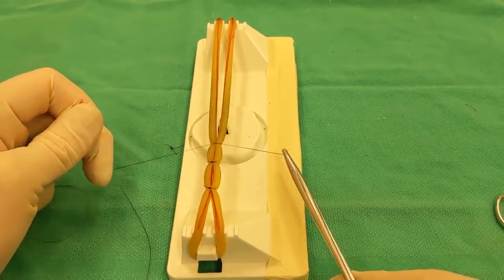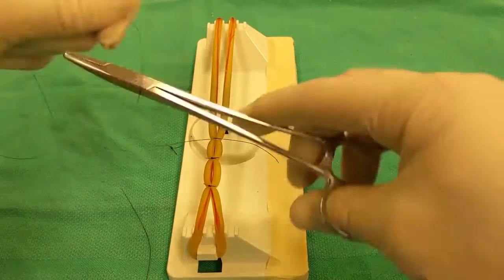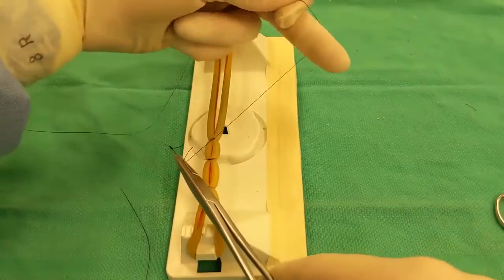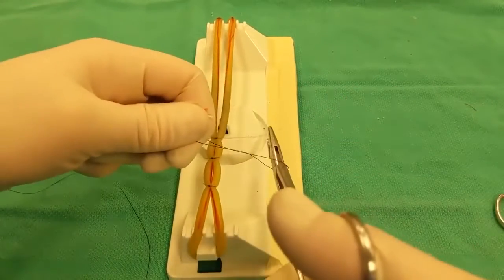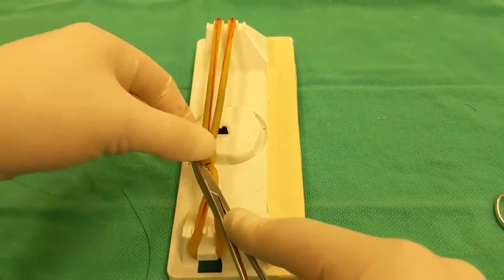You want to maintain tension on that, because most friction knots, you have to keep tension on your first and second throw. You want to hold it for at least a little bit so that you can really crush that tissue and make sure you get all the slack out of the suture.